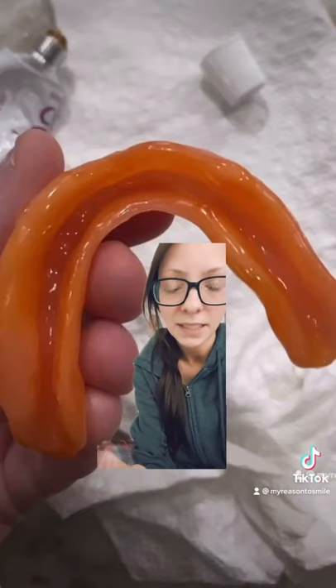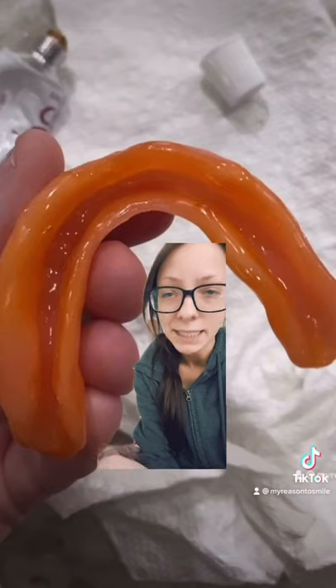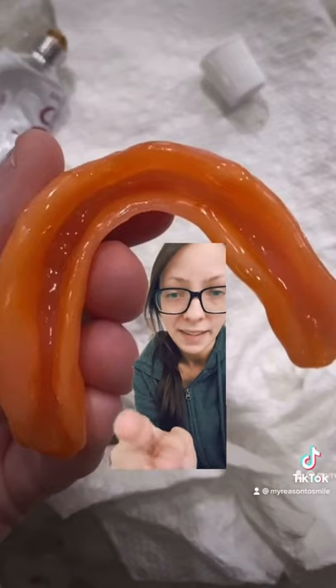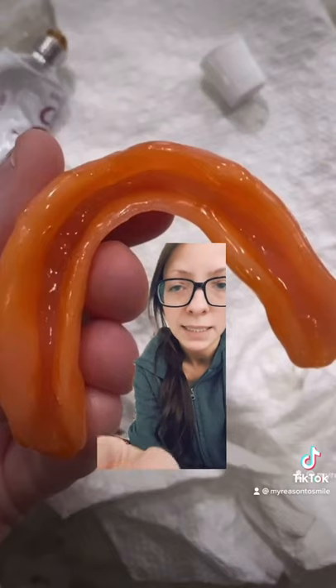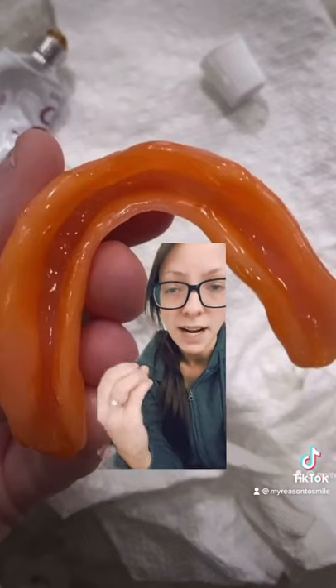This is my lower denture with a new application of cushion grip. As you can see my lower gum ridge is very thin and the cushion grip went and filled in all of the little gaps and spaces so that it would fit very very snug.